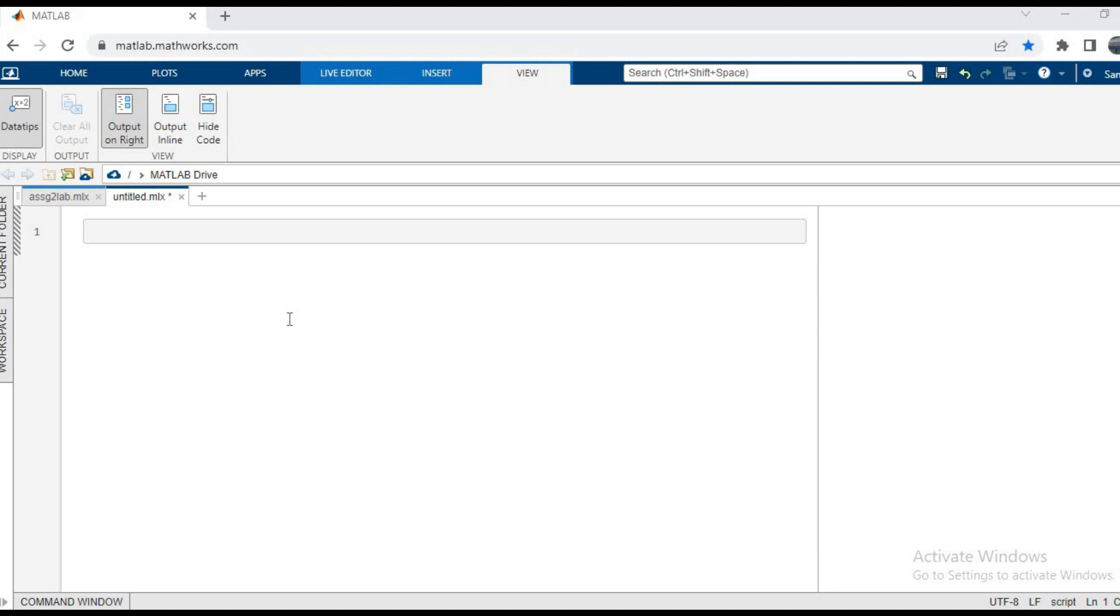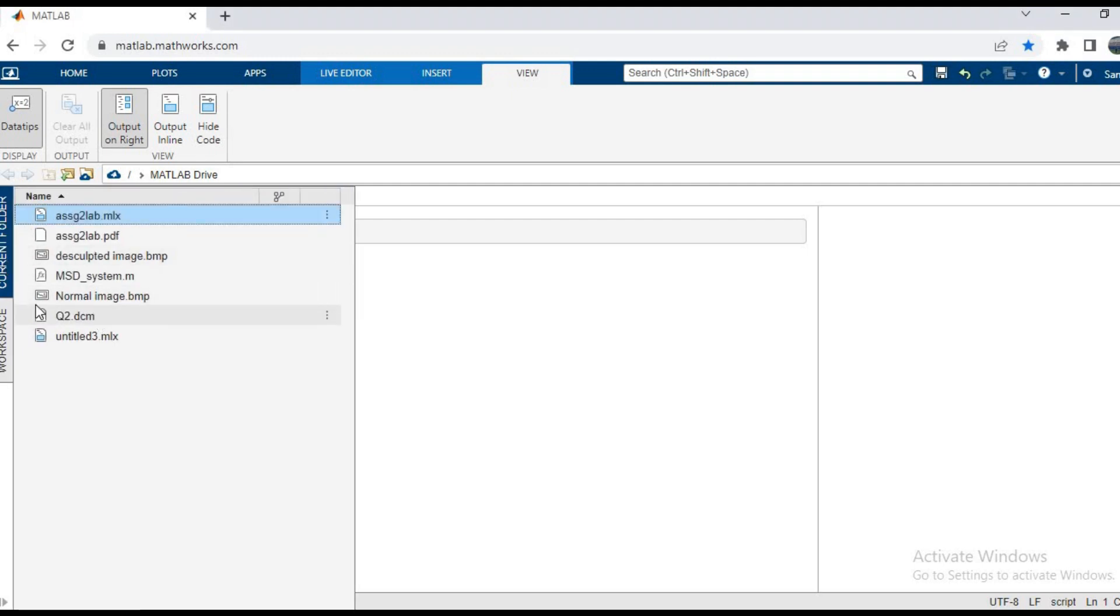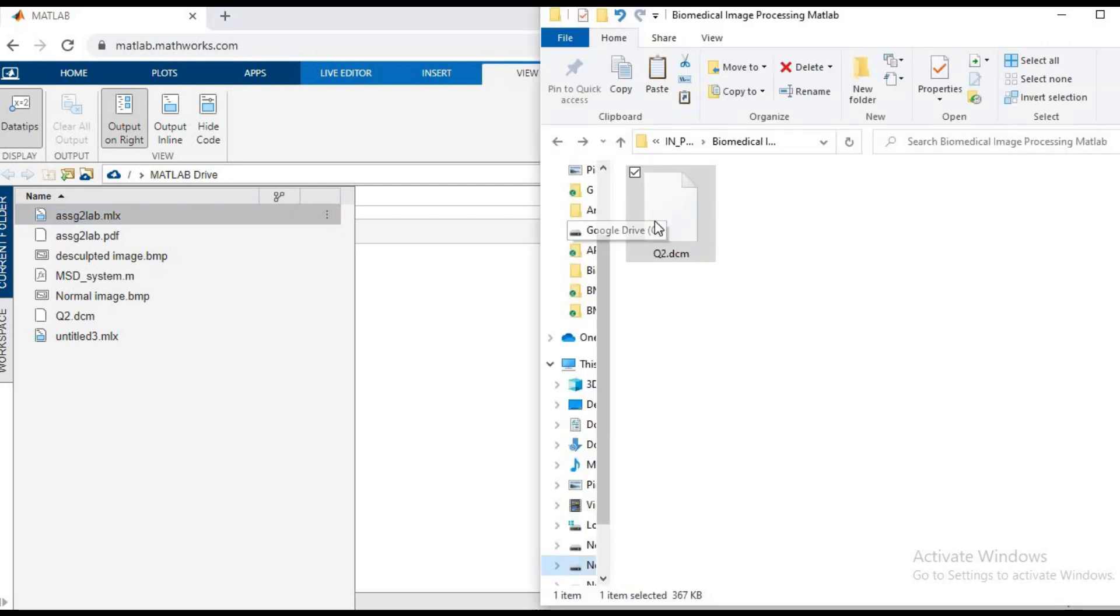So I'm logged into my MATLAB Online. In this, if you go to the current folder, you can see that I have this image. But if you do not have the DCM file, which is the DICOM file, you can go to the folder and drag it inside your browser.